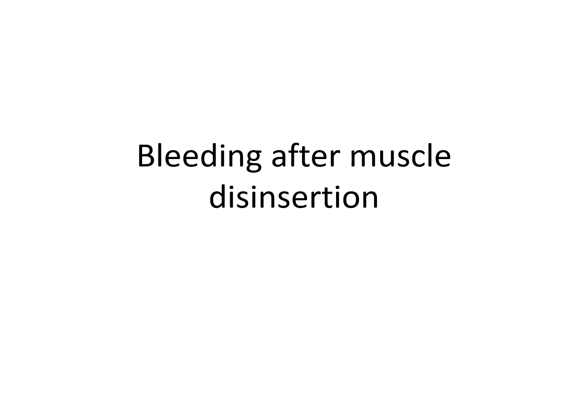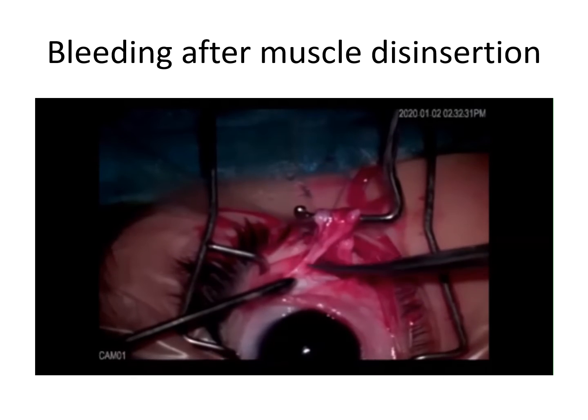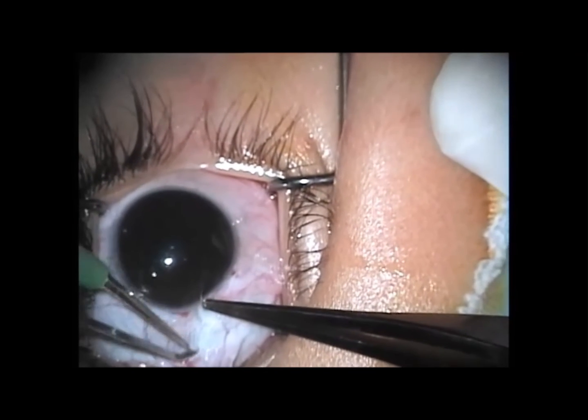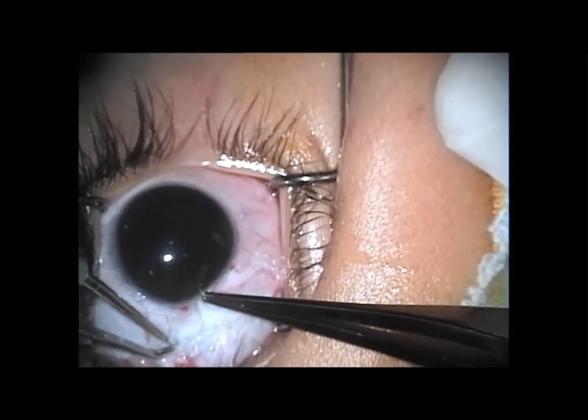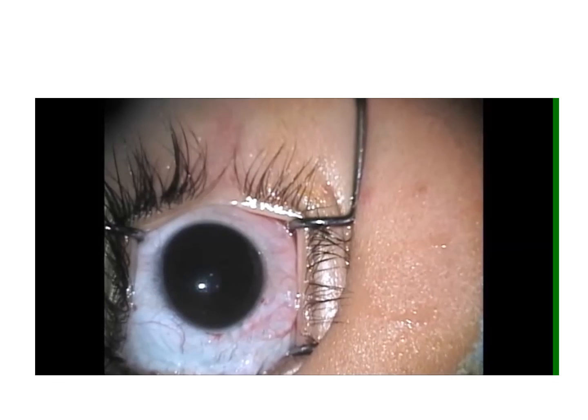Bleeding may also occur after muscle disinsertion due to cutting of the muscular arteries. The bleeding is usually minimal and can be easily controlled with gentle compression with a sponge. Alternatively, you can apply light diathermy anterior to the muscle insertion, either before or after muscle disinsertion.